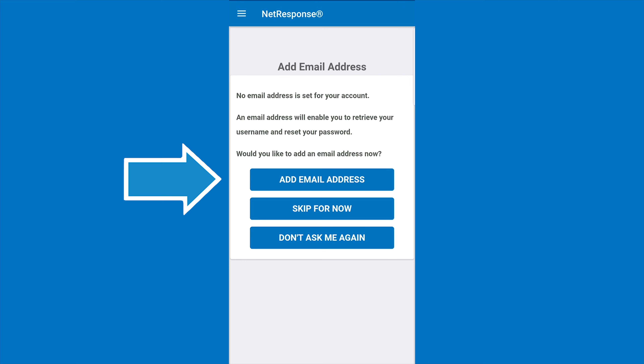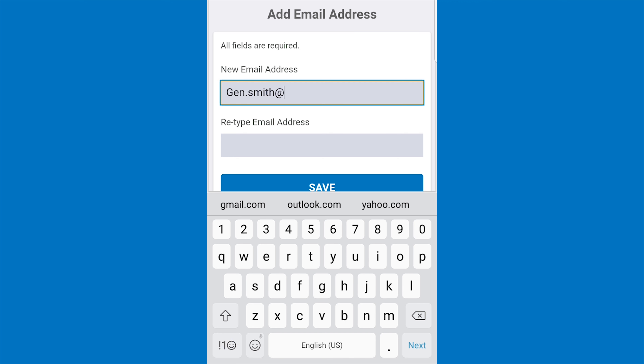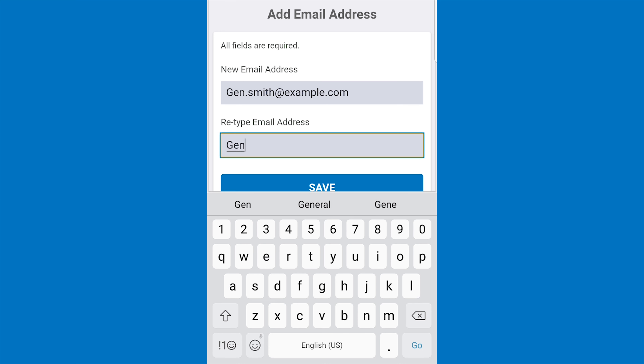Once you have accepted the Terms of Use, you will be prompted to enter an email address for your NetResponse account. This will be used to help you recover your username or password if you forget them. If you don't have an email address or prefer not to provide one, simply click Don't ask me again or Skip for now.